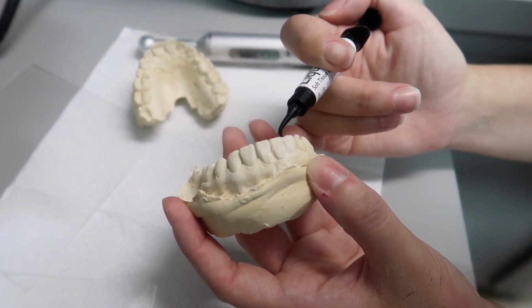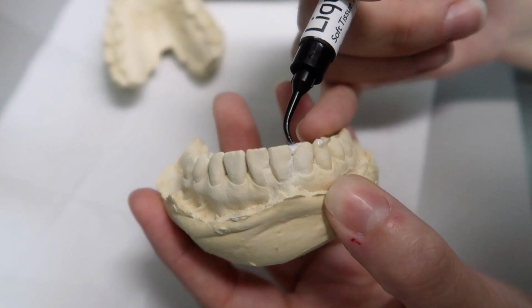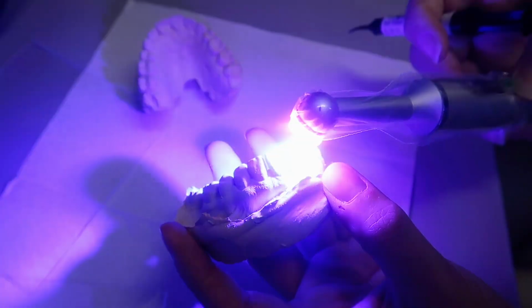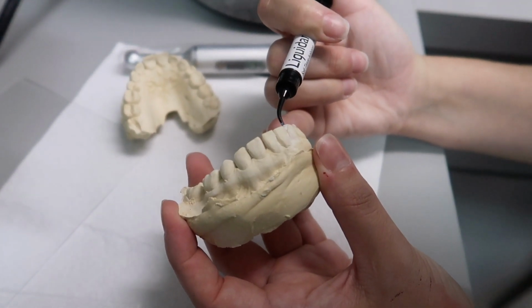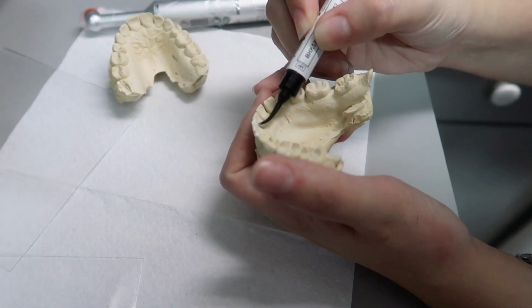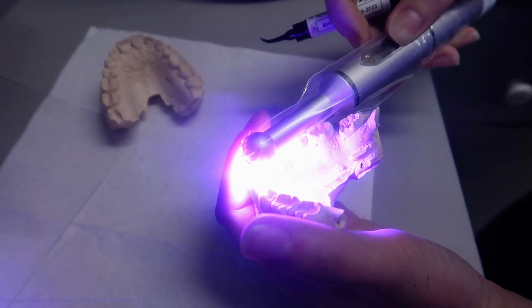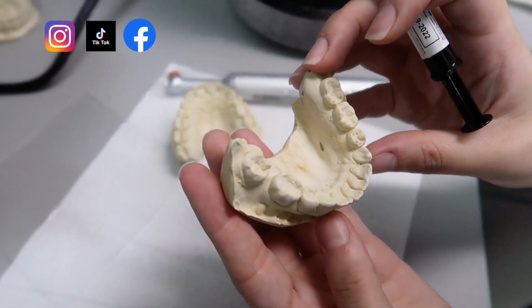So here you see how it's going to get tricky because it's like right in between. So I'm going to build it up like that. And I'm going to go a little bit more. So we're basically kind of just filling in all these voids to make it work, because the other option is bring the patient back and take new impressions and then re-pour. I think that would work for now.